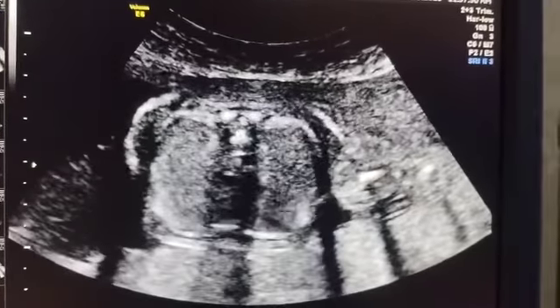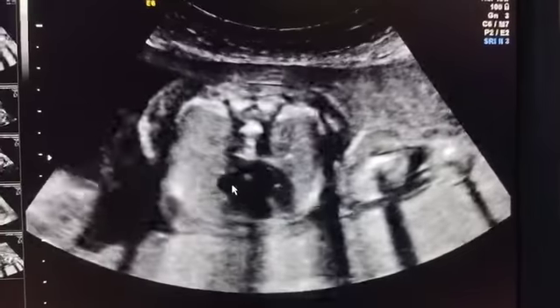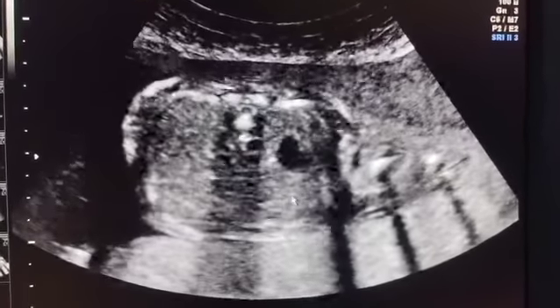These three are the dots of the vertebrae, vertebral body and posterior element. These are the ribs. These are the level of cardia. Now I sweep down and I get the stomach bubble.